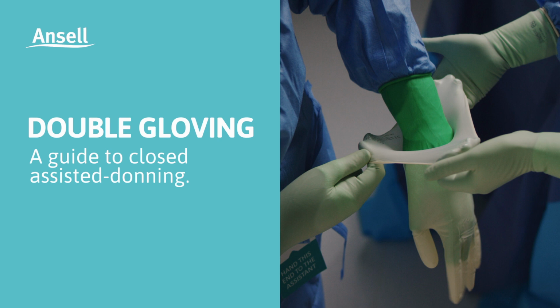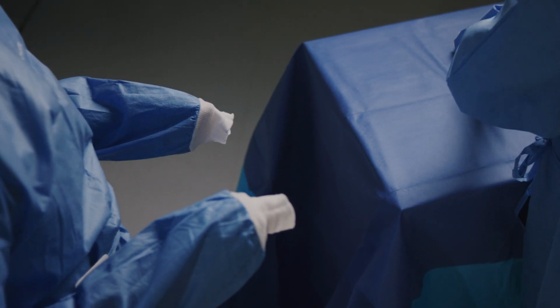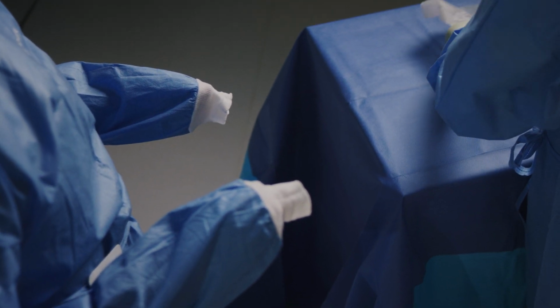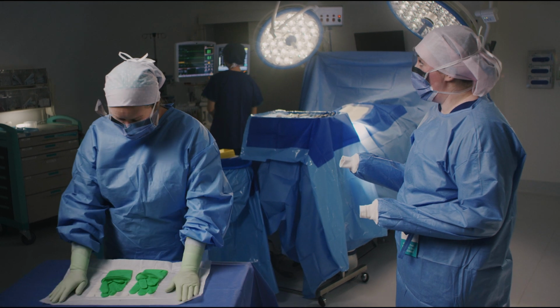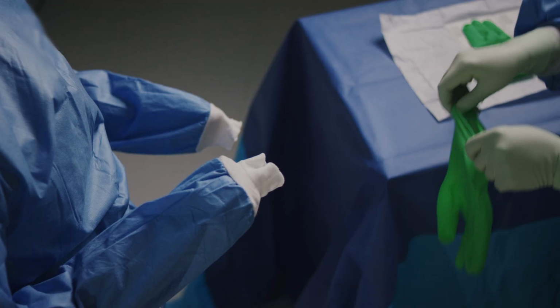Closed donning is recommended best practice to prevent contamination. Hands remain inside the sleeves and should not touch the cuffs while donning is assisted by another scrubbed team member. The gloved scrub nurse grasps the glove firmly and steps away from the sterile field.